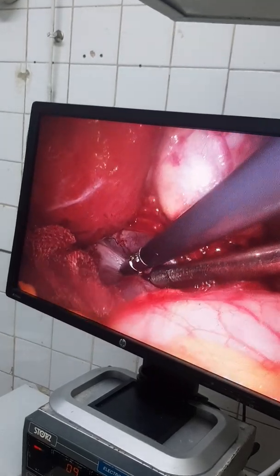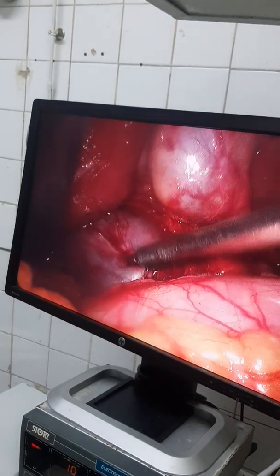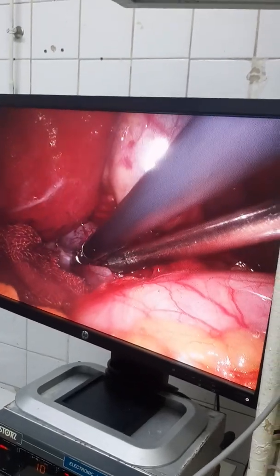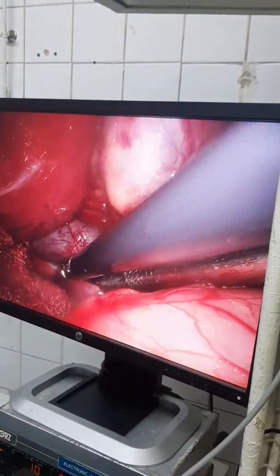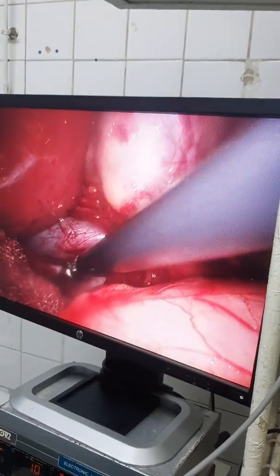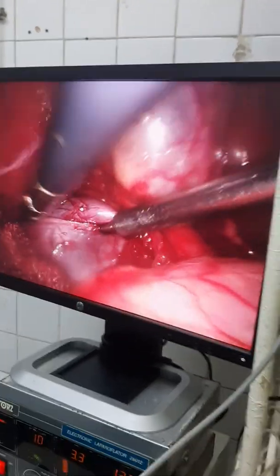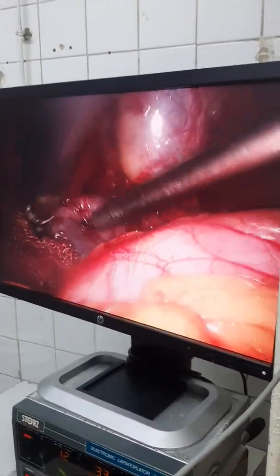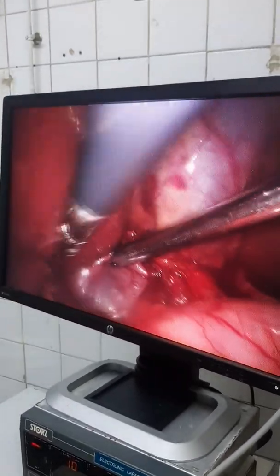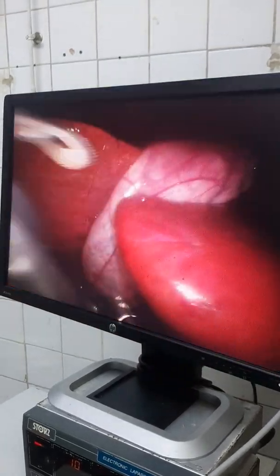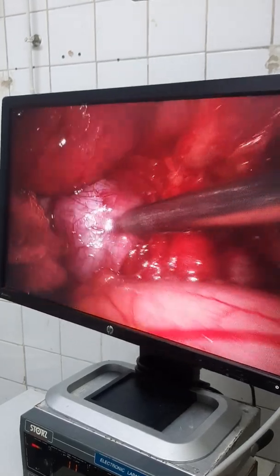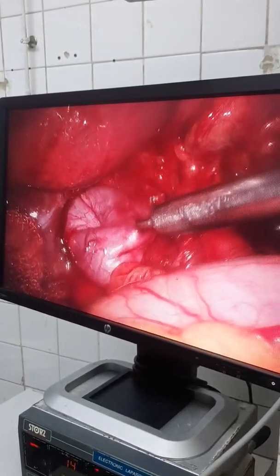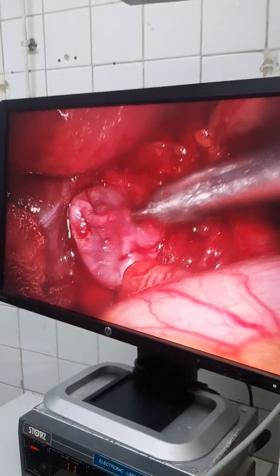We are compressing the cyst now and trying to do the circulation of the cyst. 40 ml has been sucked now and we are still doing suction. We are continuing suction of the cyst — it becomes decompressed more and more. The cyst is more decompressed now.